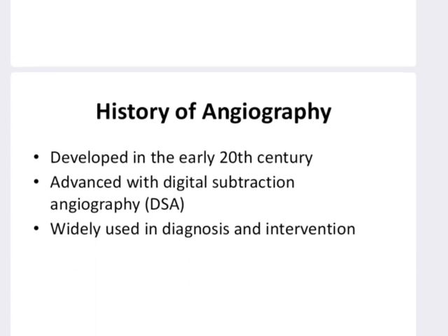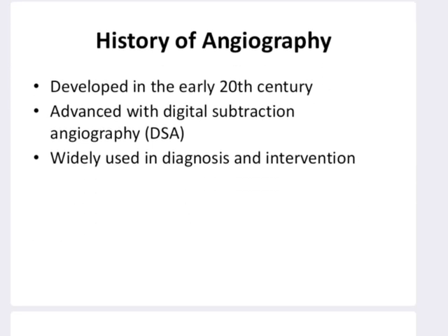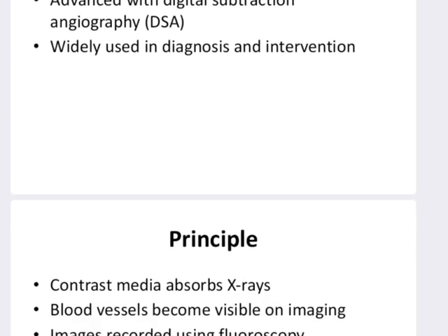Next is about history. What is the history? Actually, this angiography method was developed in the early 20th century, and after that it has advanced with digital subtraction angiography, that is widely used for diagnostic purposes and also for interventional purposes.